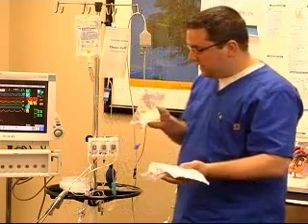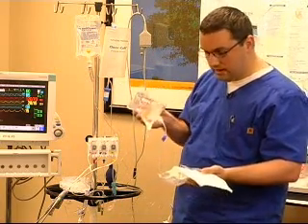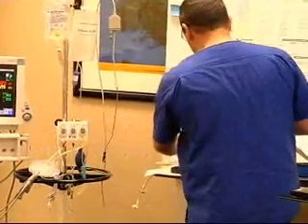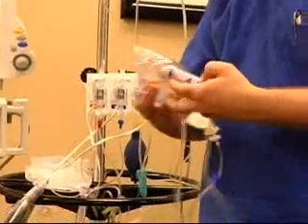Again, with the same concept of trying to get the air out of the bag, you want to make sure that you don't trap any air in here. You can see I've got a little bit trapped in here, so we'll let that out. But the one thing I wanted to show you was that this comes in pieces, so it could be a little bit confusing when you take these out and it's wound up in the package. You just have to untwine that.